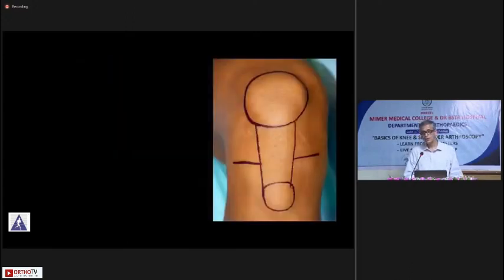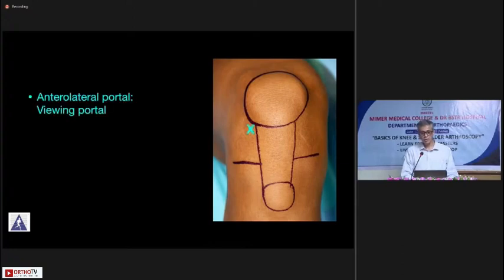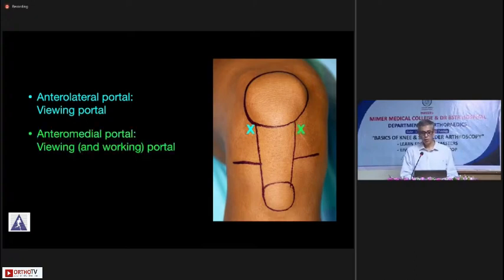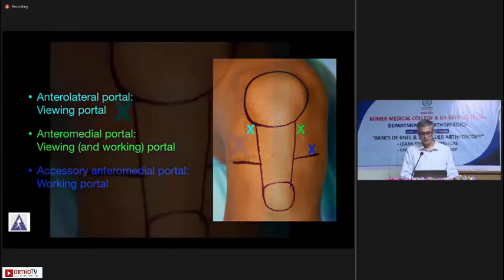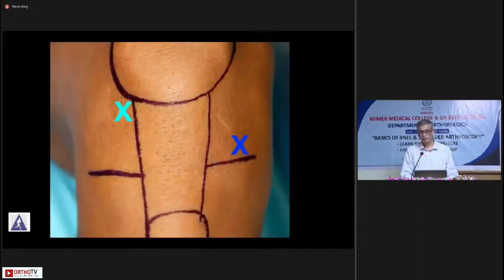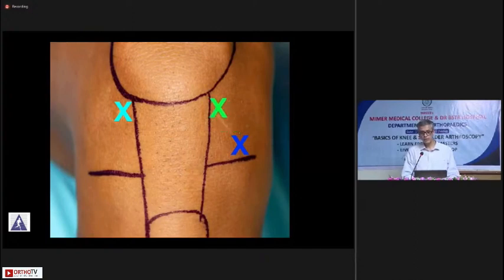For ACL surgery, I use three portals. The anterolateral portal, which should be placed high as Dr. Abhay explained, will be the predominant viewing portal. The anteromedial portal will be both a viewing and working portal. And the accessory anteromedial portal will be my predominant working portal. The anteromedial portal is made outside-in using a simple 18-gauge needle — placed too low it causes crowding of instruments.